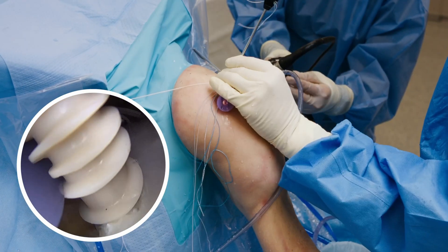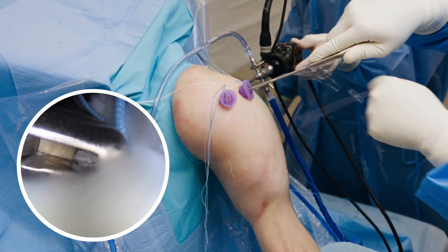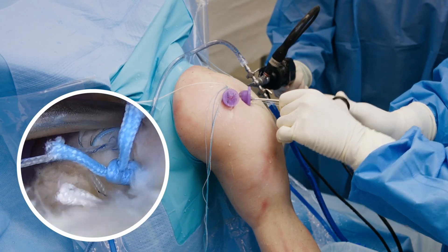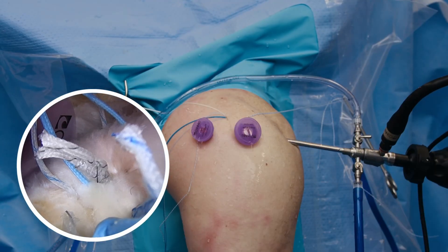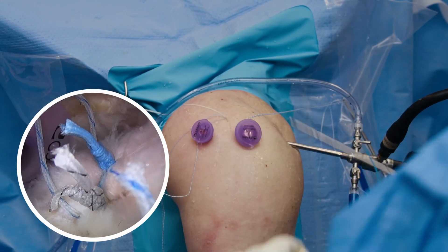I'm now placing the posterior anchor with another CROSS-FT device. In a sequential fashion, we're going to tie all of these sutures down. For this case presentation, I'm doing simple fixation points throughout the rotator cuff repair. A surgeon could use a horizontal mattress configuration or any primary repair construct that they prefer, but for this tear, which is minimally retracted, we're using simple fixation points.